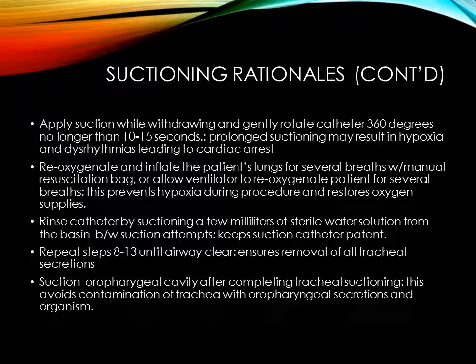Repeat steps 8 to 13 until airway is clear. This ensures the removal of all tracheal secretions. Suction the oropharyngeal cavity after completing the tracheal suctioning. This avoids contamination of the trachea with oropharyngeal secretions and organisms.